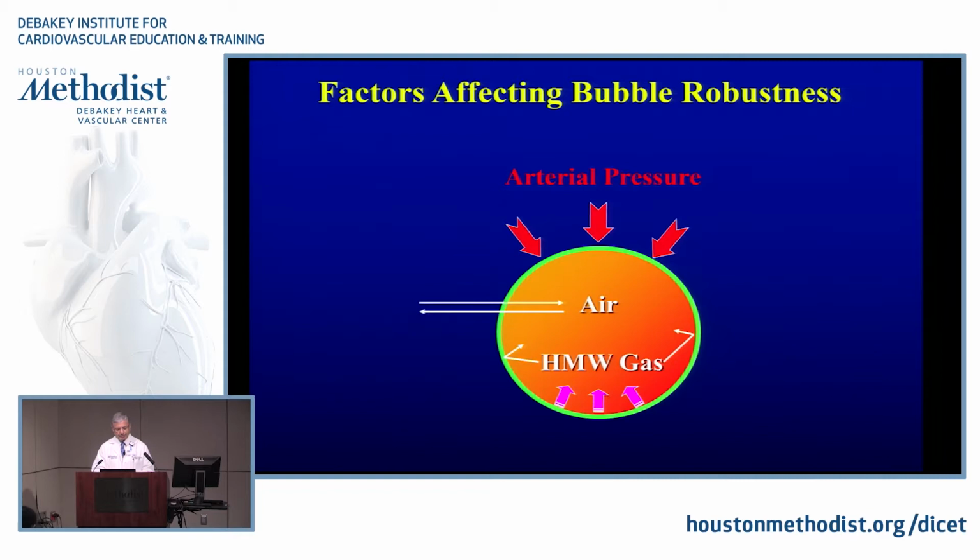So that's the field. So what you see there is a depiction, I know we spent quite a bit of time on it. The gas in it is air if you're just doing microcavitation agitation, but people have experimented with many high molecular weight gases that are much more inert, safe, obviously. And the shell can be formed of many different phospholipids, surfactants, other things that can give it more robustness, believe it or not, will be harder to destroy.